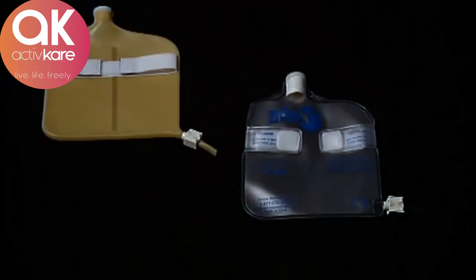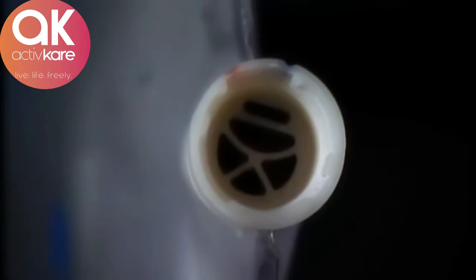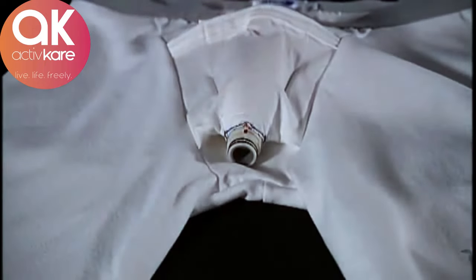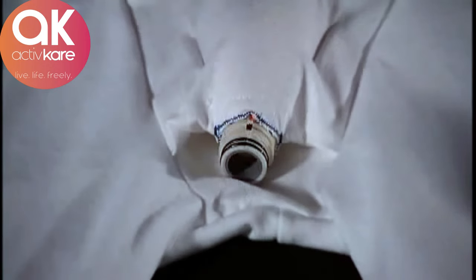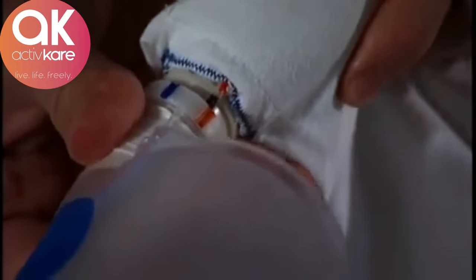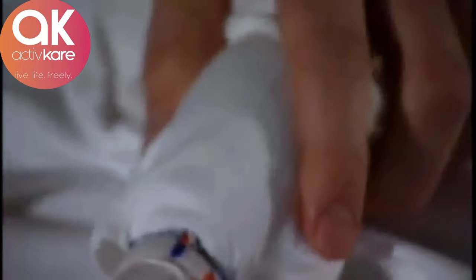The collection bags are made of durable vinyl or heavy duty latex for premium performance. They are sealed with a one-way valve to let urine in and to trap odor, even during high-activity situations like golfing or even jogging. In order to assemble the Apex system, take the receptacle and put it through the strap, and then out through the blue reinforced button hole. Then take the collection bag and attach it directly to the receptacle by first lining up the orange notches.